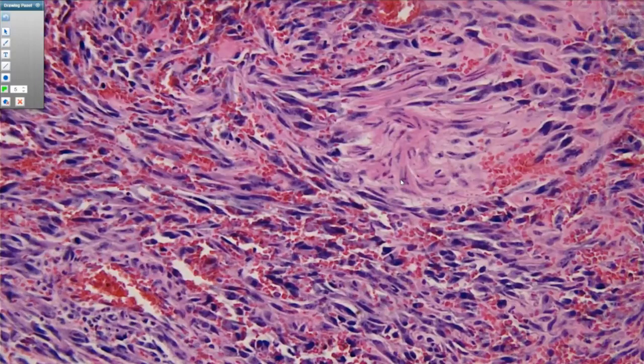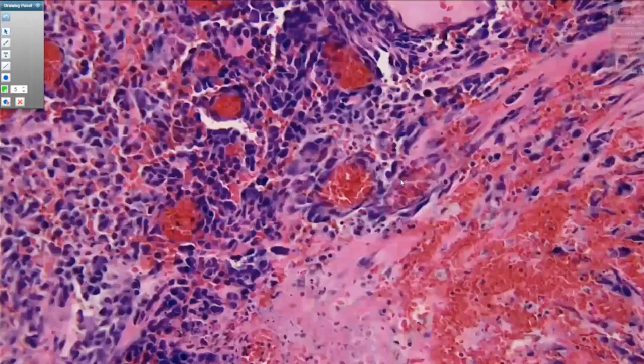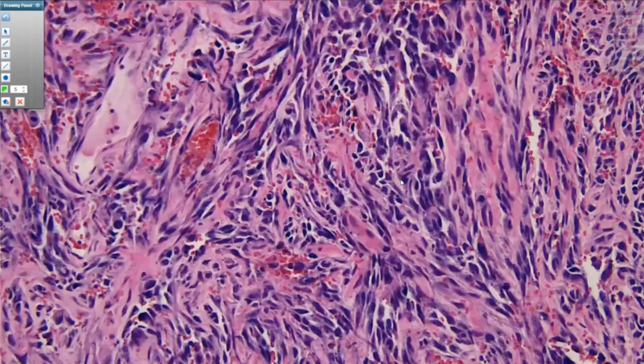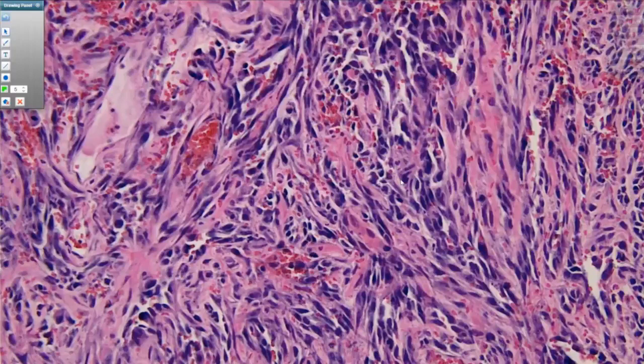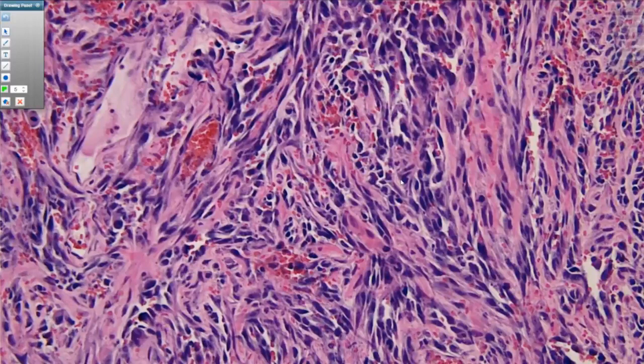Particularly on core biopsy, when you have a small sample and you may not be seeing everything, and even on excision, it's still worthwhile to rule out a metaplastic carcinoma that may either be acantholytic or have hemorrhage due to procedural issues. So in general, these types of angiosarcomas are keratin negative, although it should be noted that some epithelioid angiosarcomas can show focal keratin.